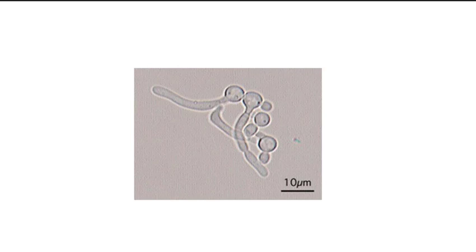This one, what do you think? This is kind of the exact same one we saw right before. These are budding cells. This is the germ tube.